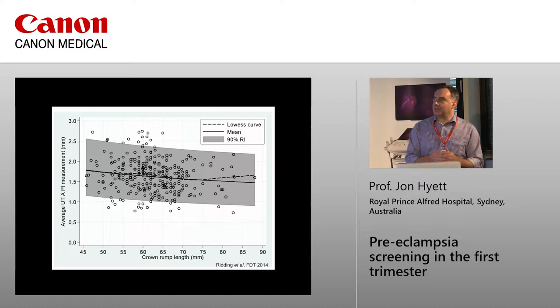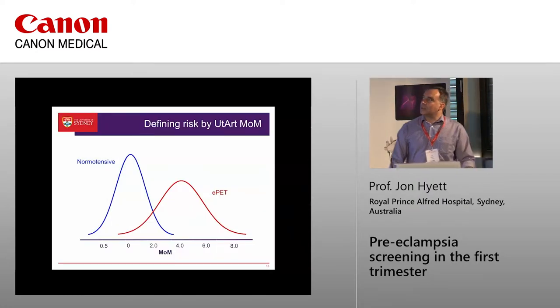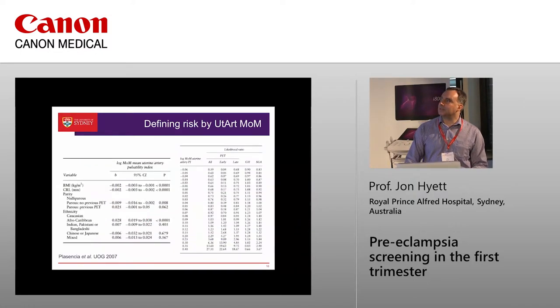Certainly for our sonographers, they quite like to have some idea of what ballpark measurement should be. And we've produced this first trimester range that you can see here. So in terms of risk assessment, we're going to convert this to a MOM value. We're then looking at a normal population, say in blue, the abnormal population in red. So as we're developing likelihood ratios based on these measures, it's very important that we make sure that we have an accurate measurement in the first place.